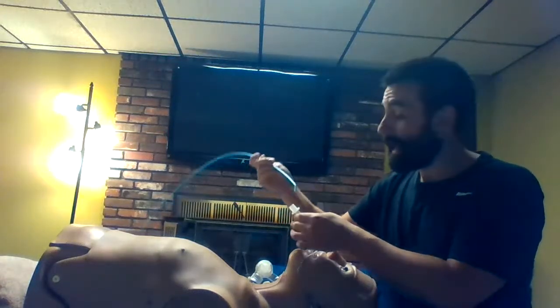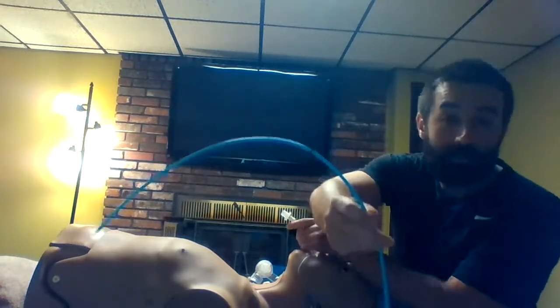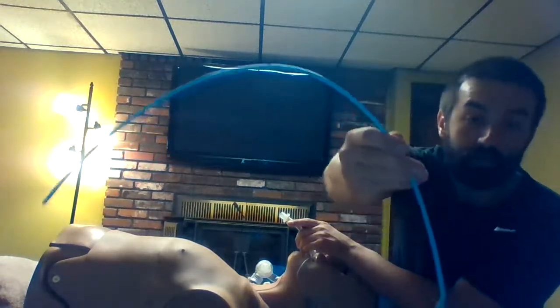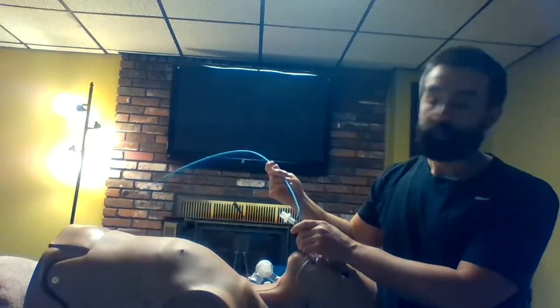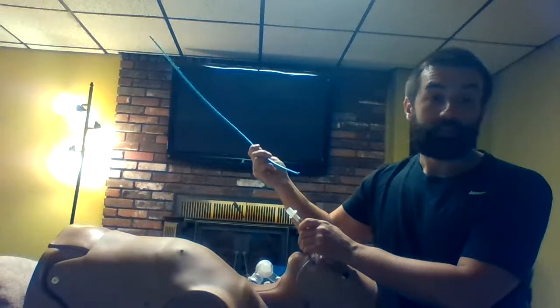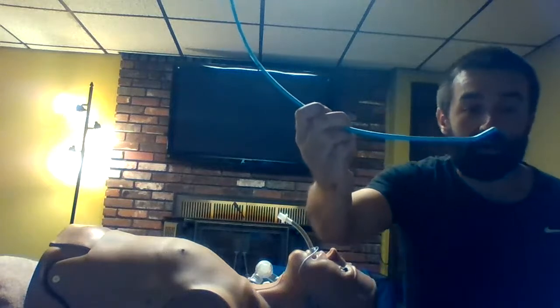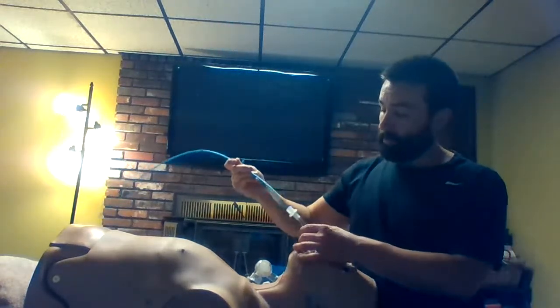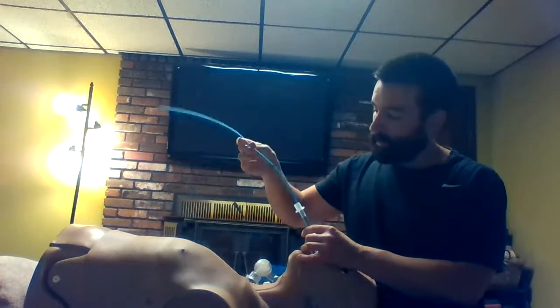All right, there's usually units of measurement marked on this bougie, and that way we know we're not harpooning the carina or something. Mine is pretty worn down, so as you can see, I got a black mark that denotes the end of an ET tube. Our goal is not to really go off the end of the ET tube in these cases, but just to really keep it as a guide wire, so to speak. Okay, so I'm going to use the end that's kind of curved there. That's going to be the end that I'm sticking in. So what we would do, I would slowly advance this. All right, and the cuff is blown.